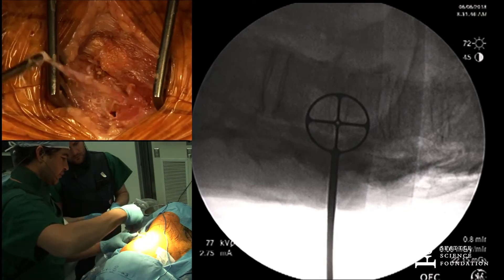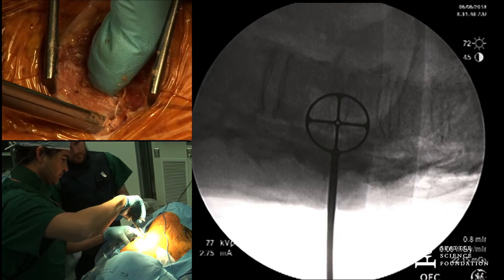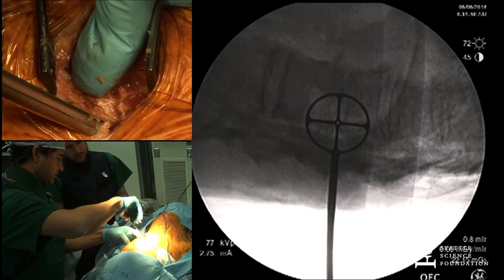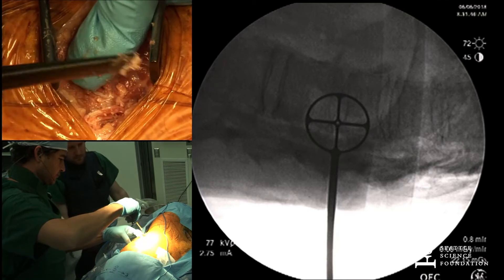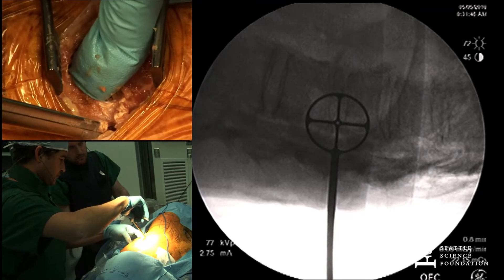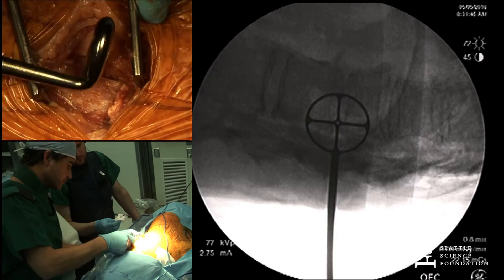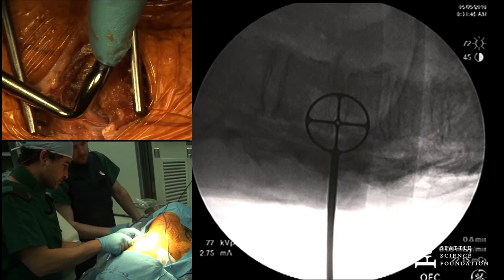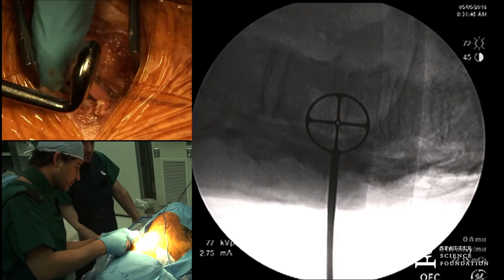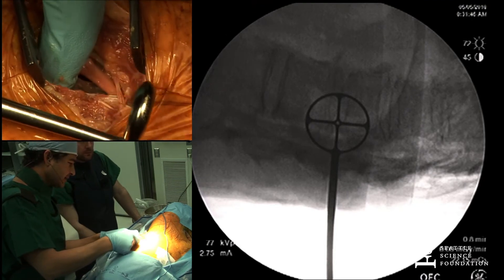We're almost all the way across the rib. There's a question: what about sparing the ribs? I have exactly the same experience — the first time I did a case I broke two ribs and that patient didn't like me at all. Every time now I take out a rib — it takes five minutes — I find it easier with better access and better definition of the anatomy. Can you split and go between? Absolutely — there's no question you can divide them. But the farther you go up in the chest, the harder it is because the ribs get closer together and more stiff. The lower down you are, the easier it is.